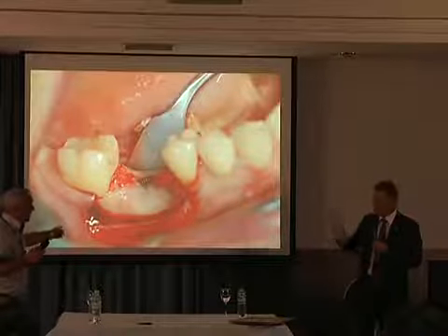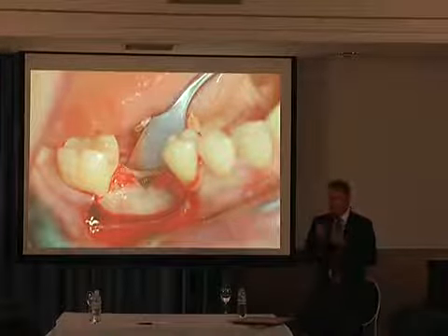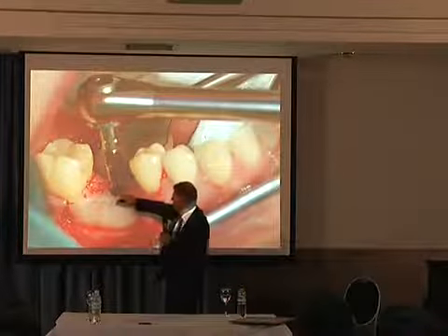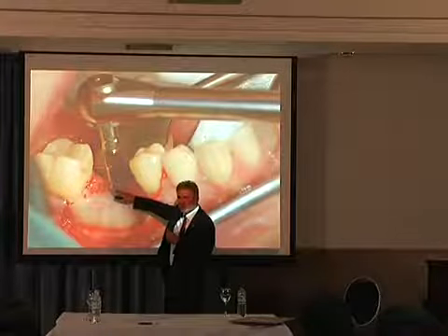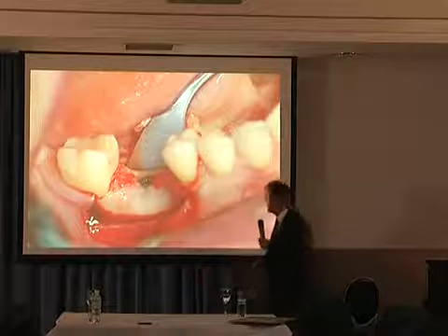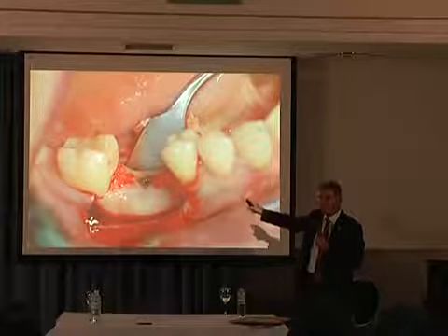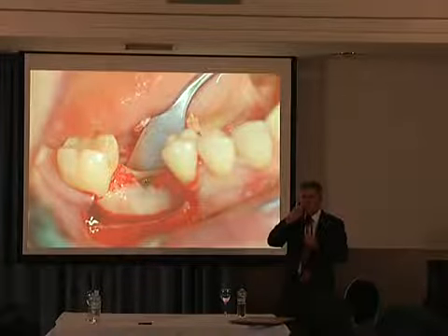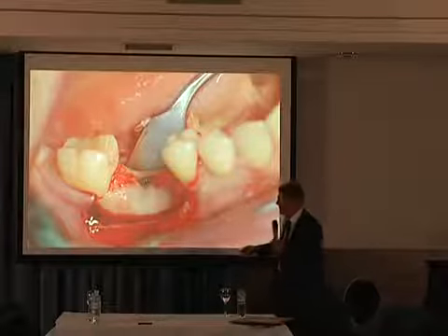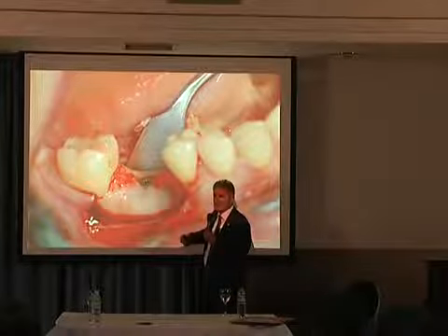Ankylos, Astra, Bicon, all these implant systems have the same conical abutment connection and surface without a machine-polished collar up to the peak of the implant. Without a neck, without a machined, polished part, 0.5 mm below the bone level. This is not the best implant system for aesthetic replacement of the central incisor in the upper jaw. But he thinks this may be an inappropriate system if we are talking about the frontal area in the aesthetic zone.